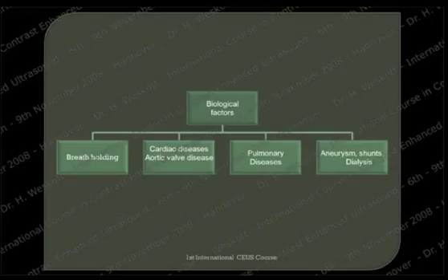Biological factors are important. If you have tiny lesions in the liver, you very often will ask the patients, please take a deep breath and hold it. If you start with this maneuver before you inject the contrast agent, then the kinetics will change. Because when you look at the patients, the veins in the neck will pump up. This is the same that happens in the liver, so the contrast agent will arrive a bit later. And when the patient exhales, then you will have a large inflow of contrast. You have to have that in mind.